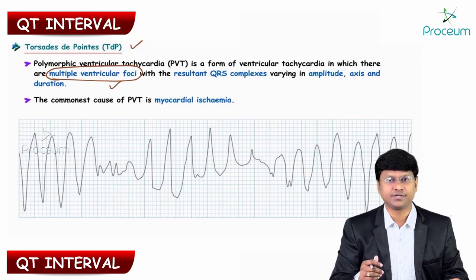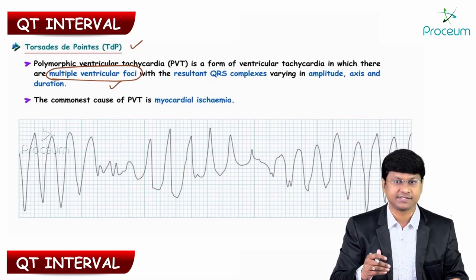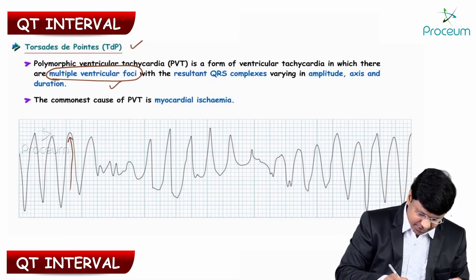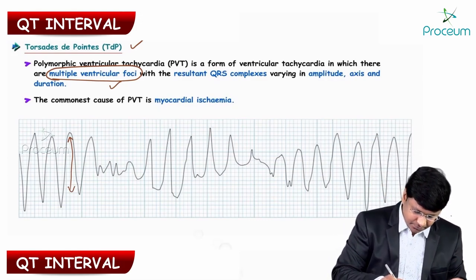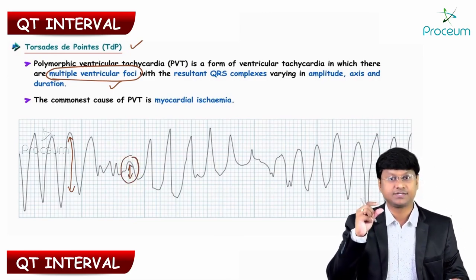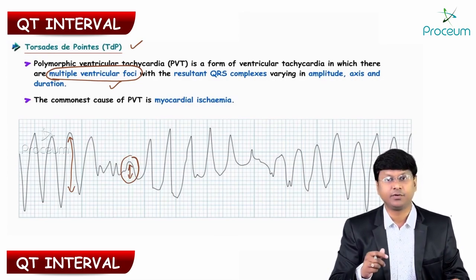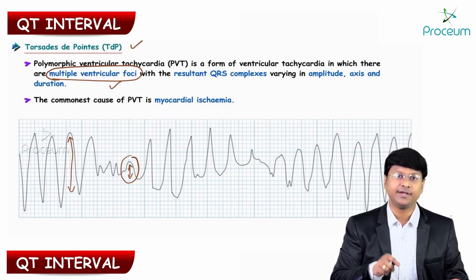Because of multiple ventricular foci, the QRS complexes will have varying amplitude as well as axis. For example, this QRS complex has a very large amplitude while another complex is small. So polymorphic ventricular tachycardia is a form of ventricular tachycardia with multiple ventricular foci resulting in QRS complexes varying in amplitude, axis, and duration.